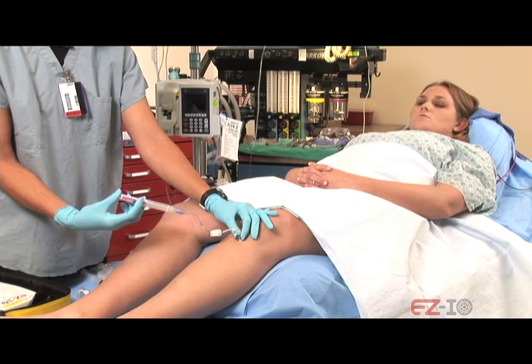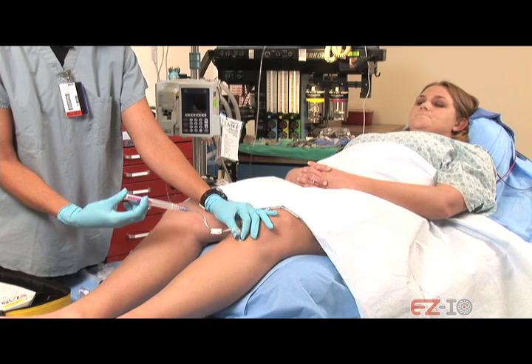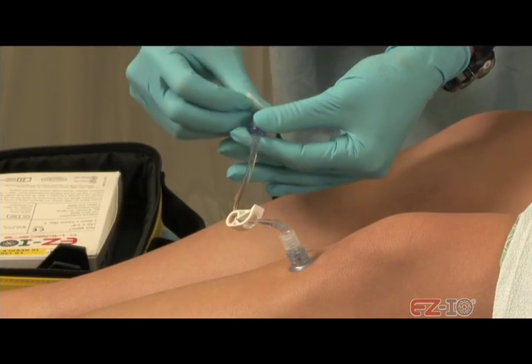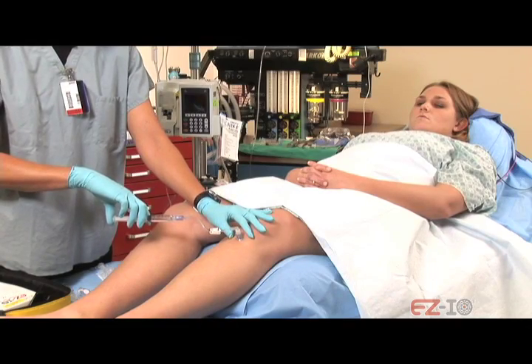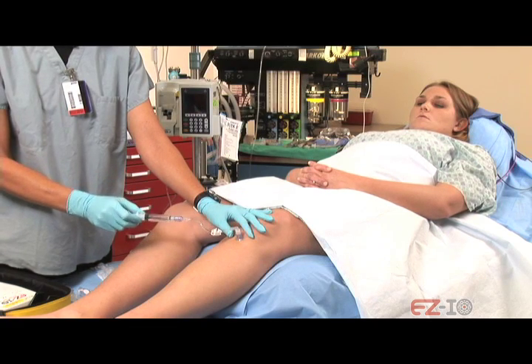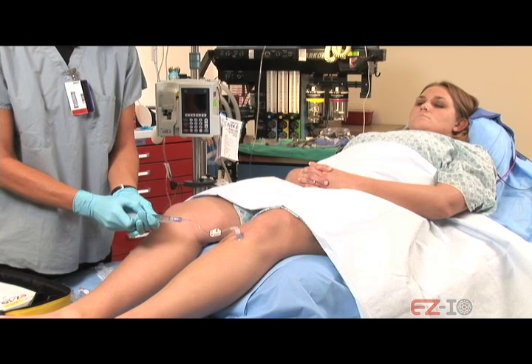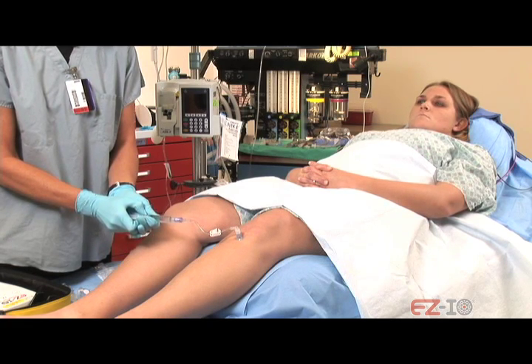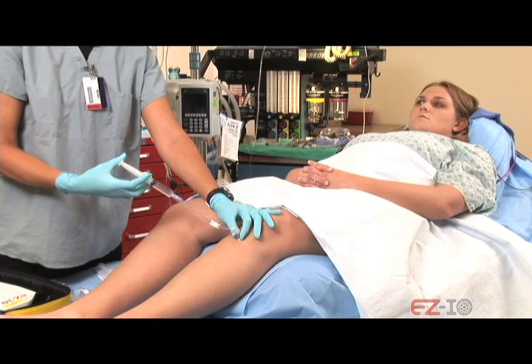And now? 3. Okay. Still doing okay? Mm-hmm. What's your pain level now? It's going down. 2. Okay. Now again, we're just going to go slowly here. Doing okay? Mm-hmm. Still doing okay? What's your pain level on a scale of 1 to 10? Like a 4. Okay. All right, now this next flush needs to go in pretty quick.